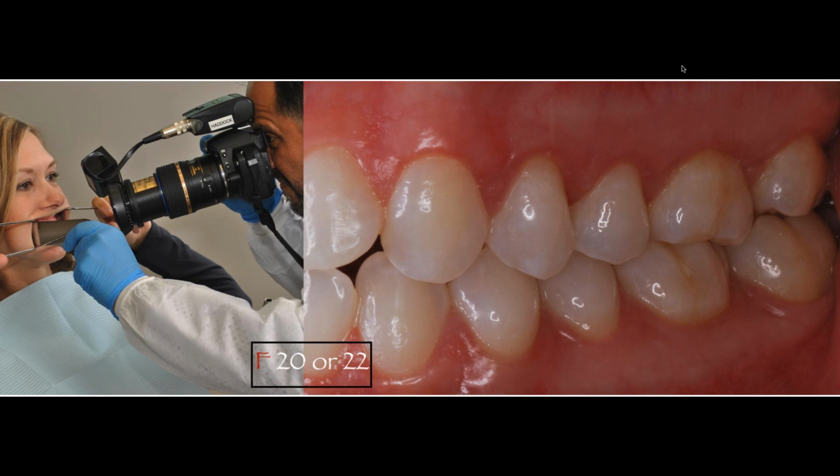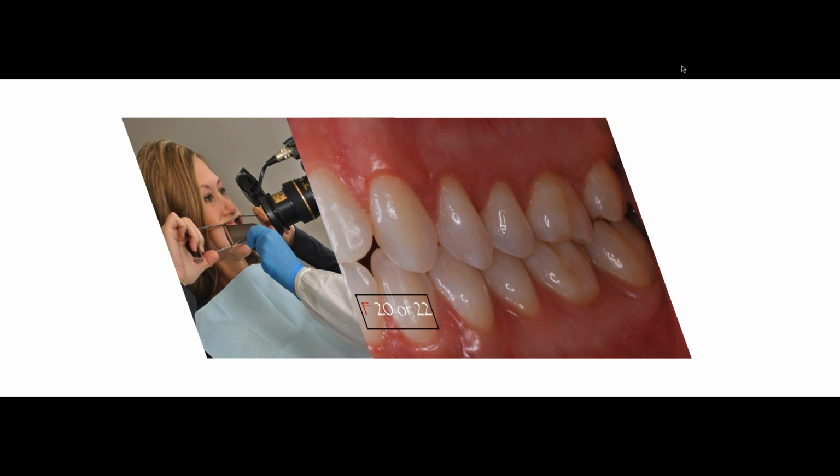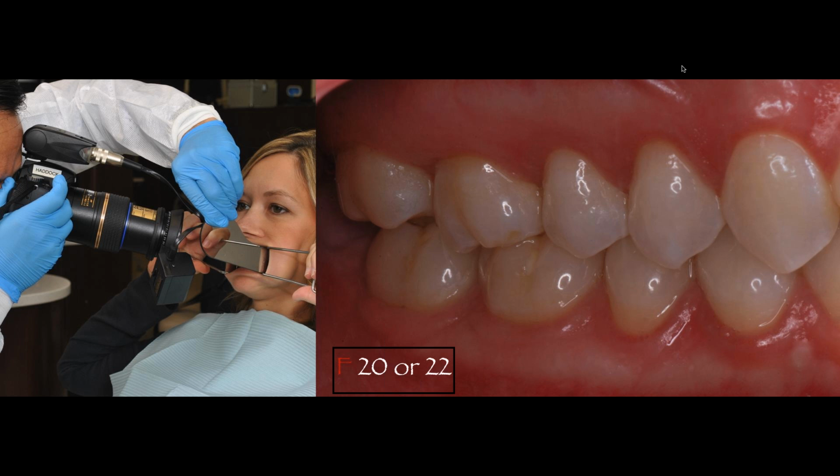Now my mirror goes in, I take it all the way back distal to the second molar, and then I separate her cheek a little bit more with the mirror. Now I have my assistant blow a little bit of air on the mirror, and now I can take my photo. And this is the photo that we obtained with this technique. Look at the distance. Look how close I am. Obviously, you have seen that my f-stop has not been modified at all during all the intraoral images.